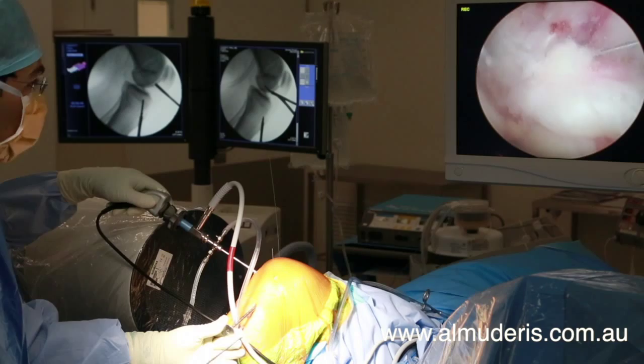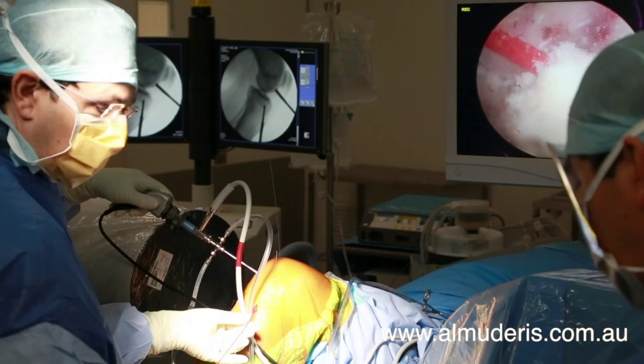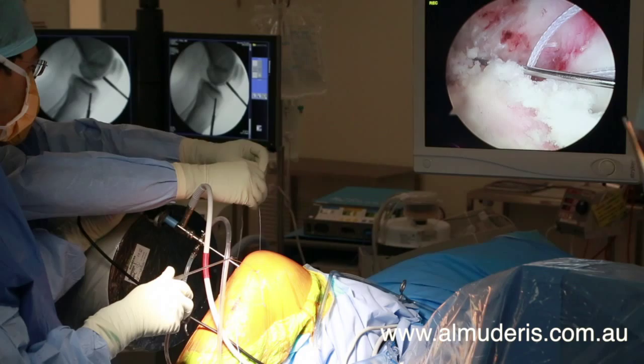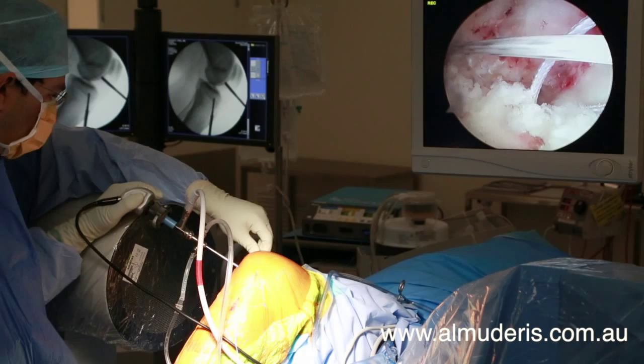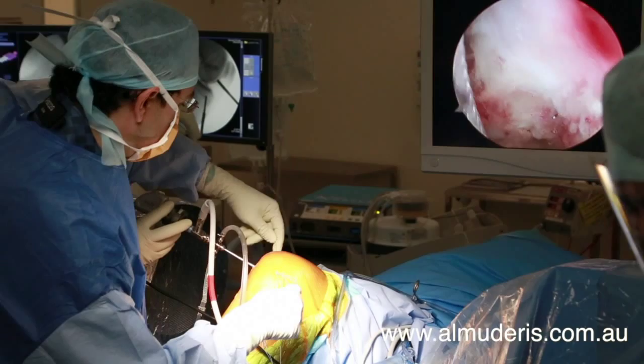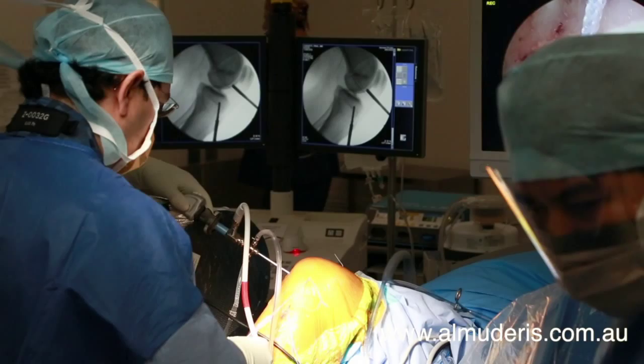Passing sutures are then introduced. This shows the anteromedial portal having both a superior suture passer and an inferior suture passer heading in different directions. The suture passers are used to guide the graft, which was prepared earlier, into the newly created tunnels.